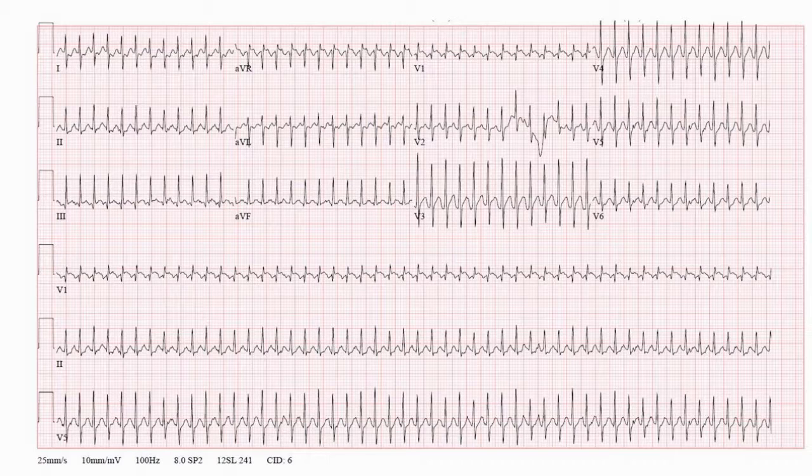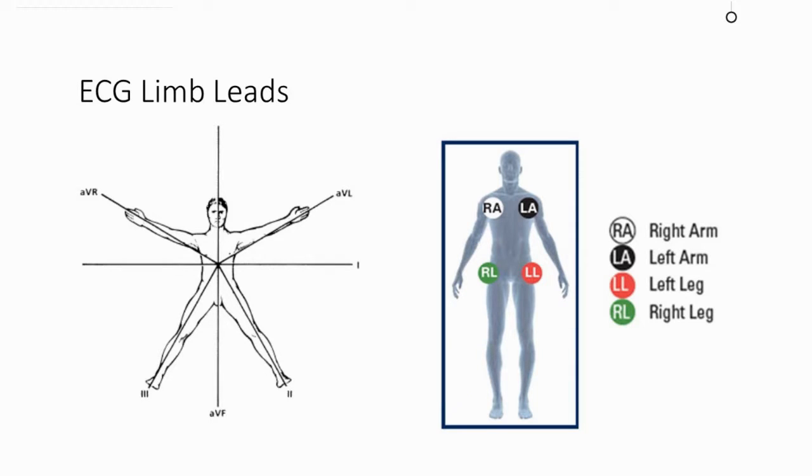Okay, so most of the time we rely on our nursing staff or our techs to place the leads correctly to get the EKG that we then interpret. But really understanding where those leads go is critical to understanding how to interpret the EKG. So today let's talk about how we place these leads, where they are, and how that translates to this printout that we see, this essentially 2D representation of a three-dimensional structure.